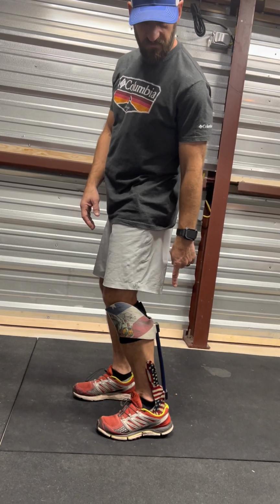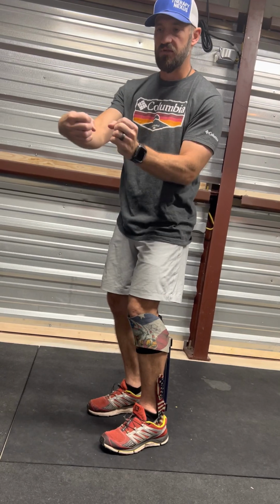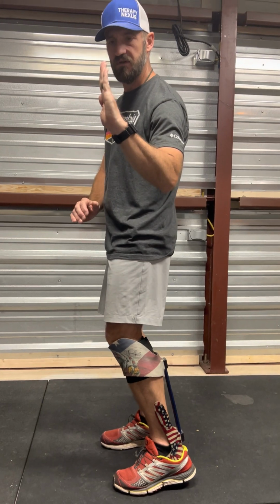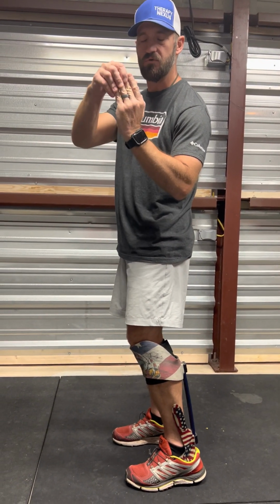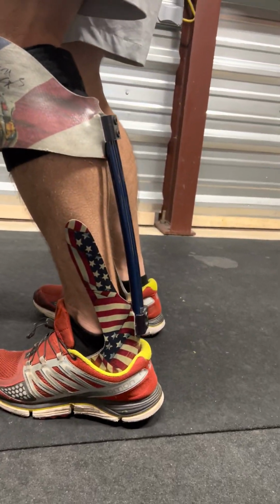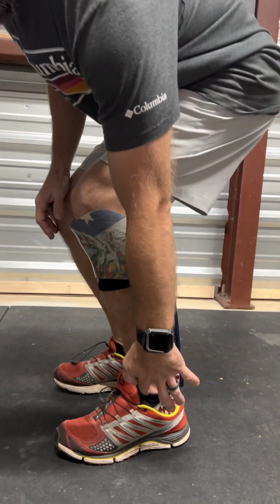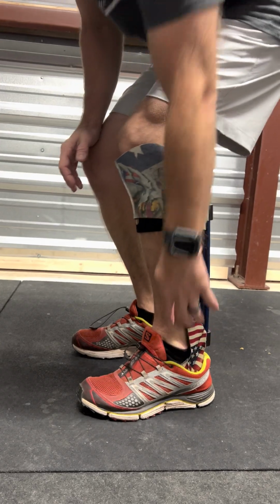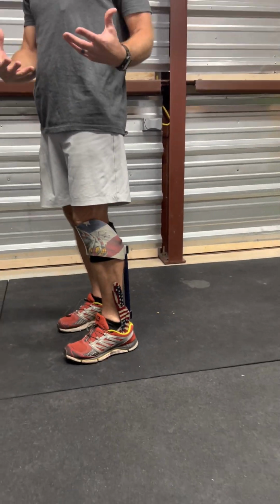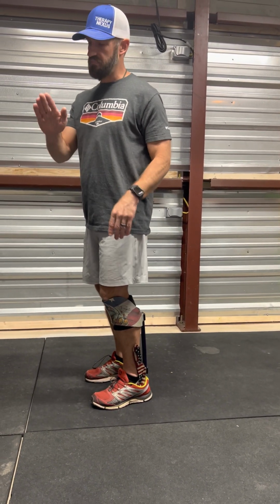And that's one of the reasons why they chose these round struts, because they'll twist and they'll turn. The flat strut that's on there only kind of goes like this. It will get a little rotation, but the torsion that these will allow is really cool. So it can unload you in different angles. And also, since I'm not injured, I have a whole lot more motion I can tolerate. Some people with a bad arthritic ankle inside their foot won't allow that much. Some of them barely have 5 degrees of motion that they can tolerate.